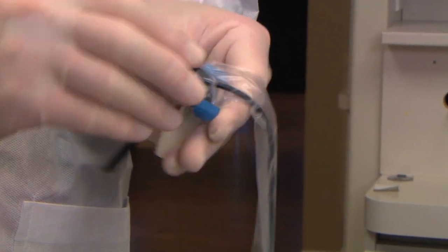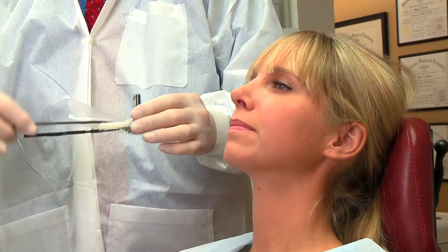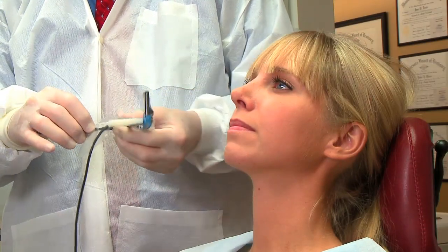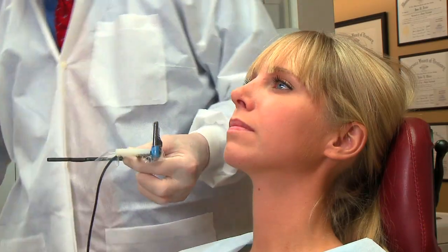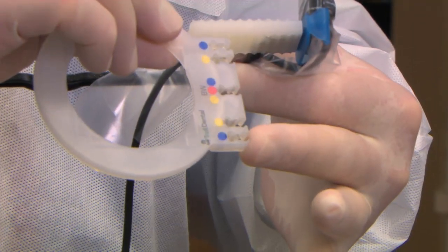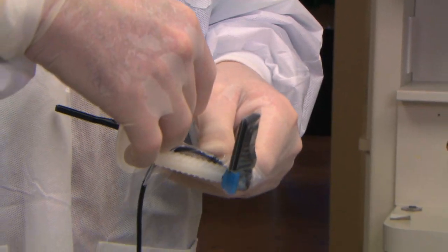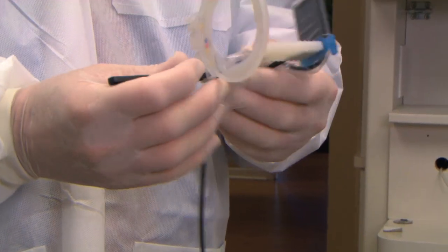Push the sensor halfway through the claw to use as much of the active area of the sensor as possible. Keep the cable along the arm of the holder. On the aiming ring, the blue dots indicate the anterior positions for both upper and lower. Snap it in place, and you're ready to take the maxillary central incisors.